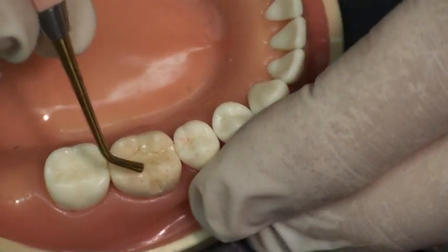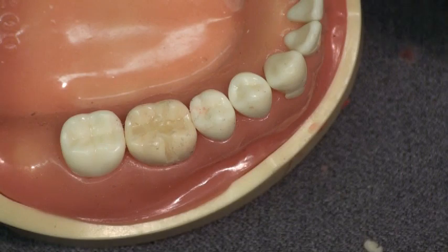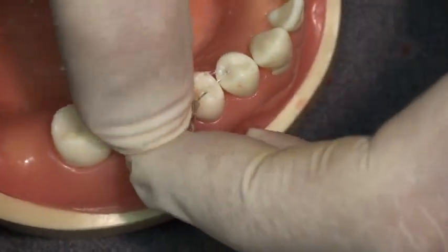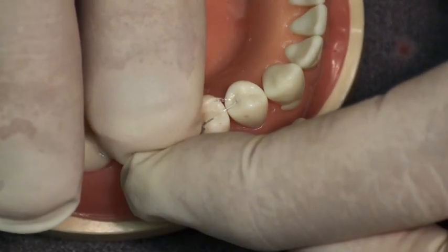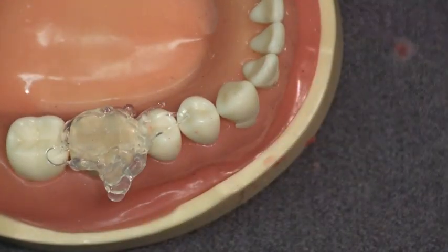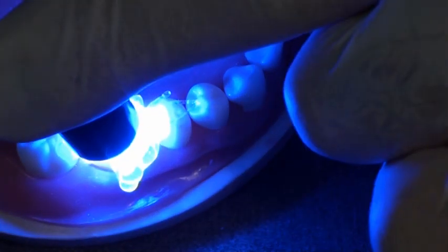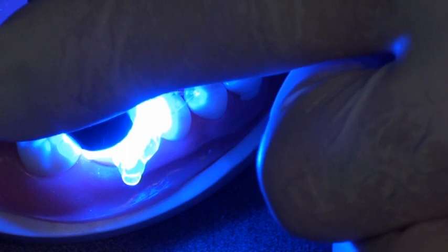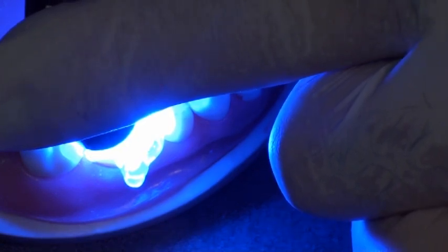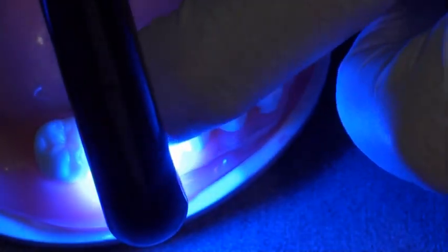As soon as I feel that I have removed all the excess composite, leaving only a slight excess — as you can see, this surface doesn't appear to be well formed — we can now take the clear custom matrix, place it back over this tooth, and place pressure on it with our finger, forcing the composite into its original surface that the patient would be comfortable with as far as their occlusion is concerned. We'll also be able to cure through this, curing in the original anatomy, surface texture, and occlusion that this patient was comfortable with. We're going to create a surface that is not air inhibited, needs no polishing, and is as smooth as the original tooth surface and the wax that we were able to burnish with our finger. I'm going to cure this not only from the occlusal surface, but also from the buccal surface.